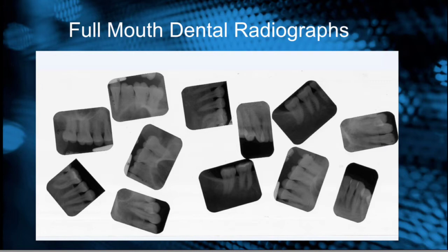When you talk to your staff about taking a full mouth set of x-rays, and you say, please take the full mouth x-ray, and they hand you back a bunch of films that are upside down and backwards, that's not really what you're thinking. You want them to be organized. So a full mouth dental x-ray, in a way, is a basic image portfolio.